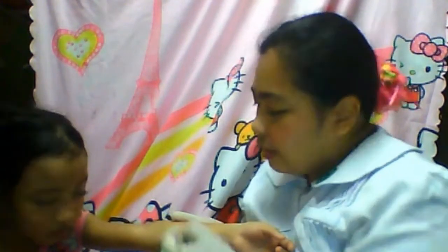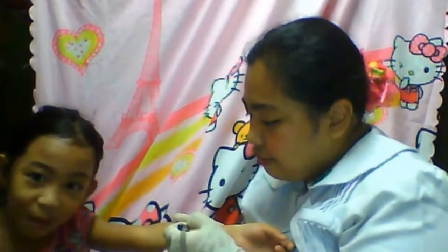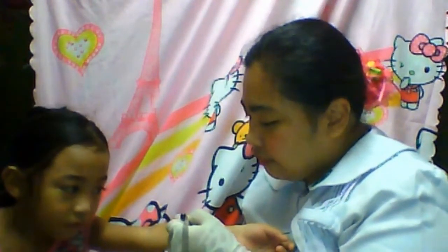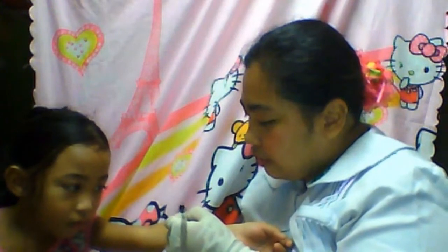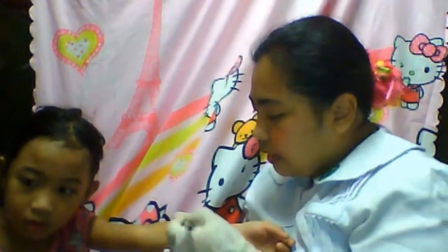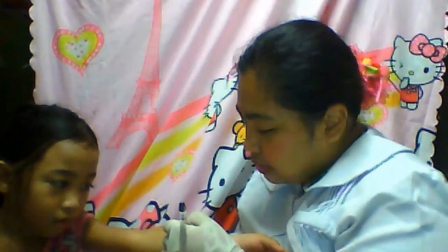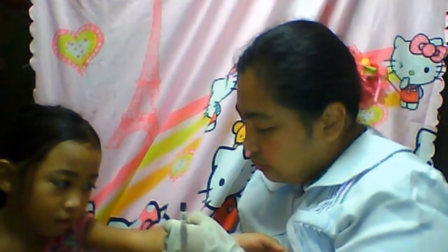Okay, and then write the medication. So for example, we have here penicillin. You will label penicillin, and then the date, which is 7.